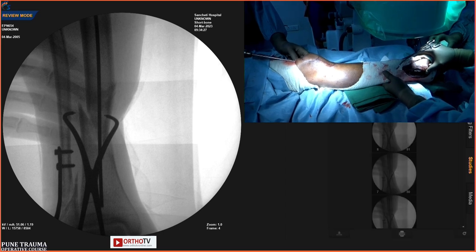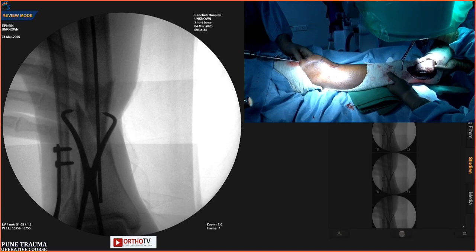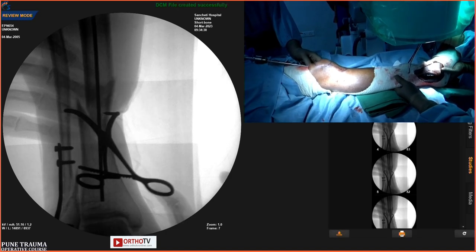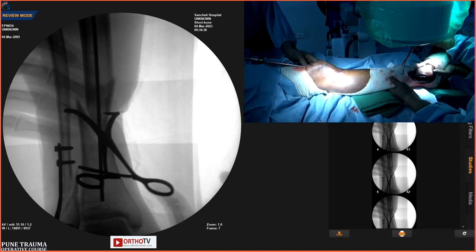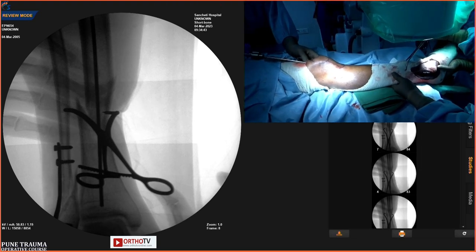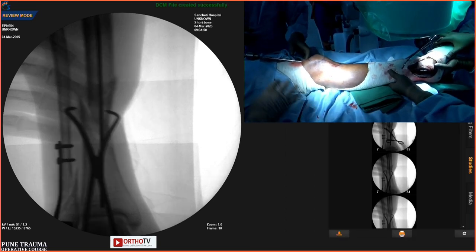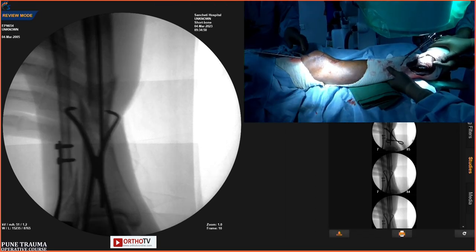I think your question is different, since the bead was way higher. You are asking why ream the distal fragment at all? A 7 mm reamer is sufficient. He wants to know, because of the fear of displacing the distal fracture lines, why ream?